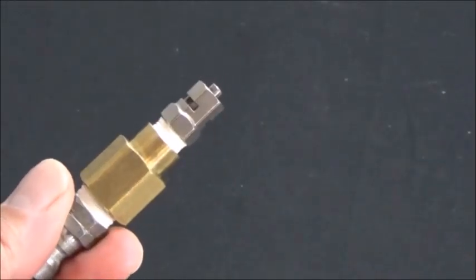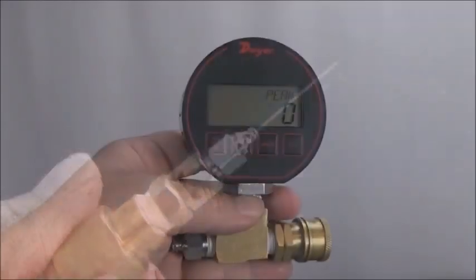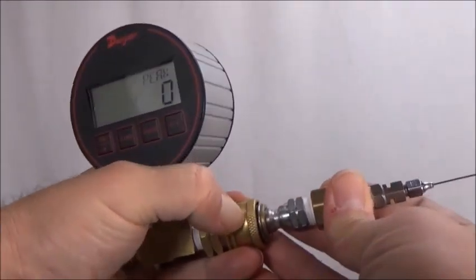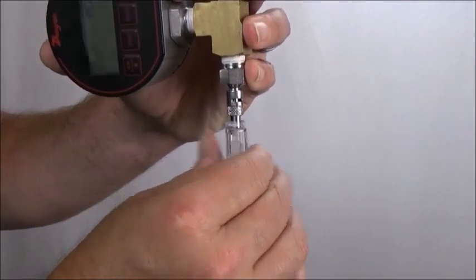Attach the 21-gauge needle and adapter to the pressure gauge. Finally, attach the pressure gauge directly to the syringe — no connector tubing.